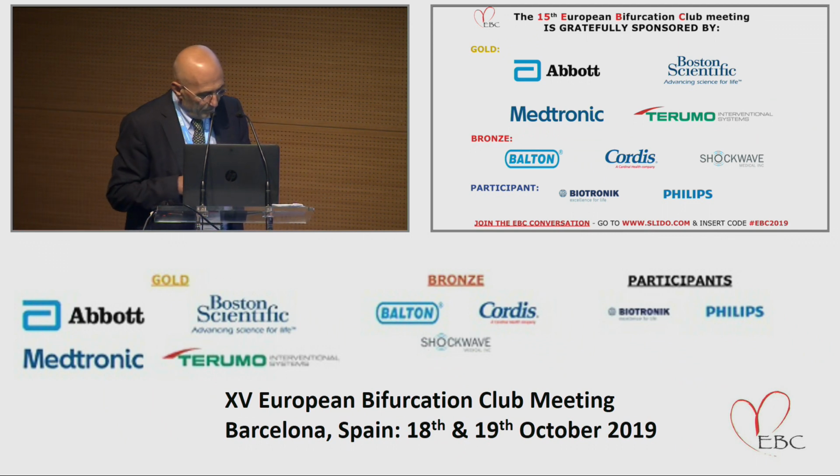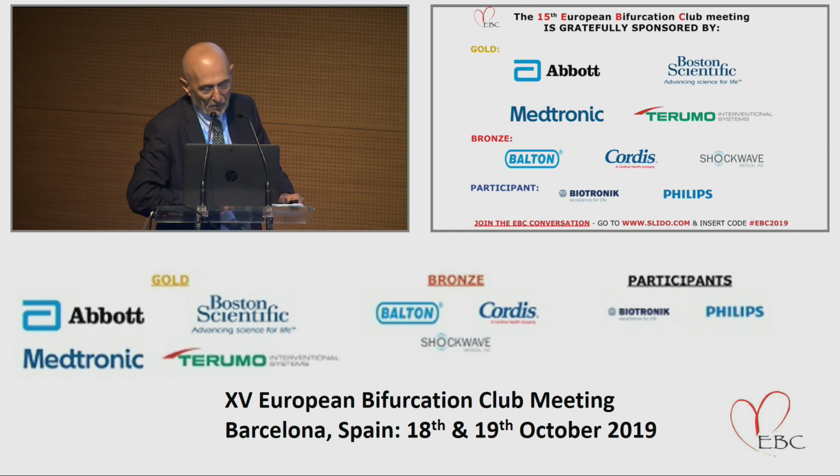So I'm trying to take the part of Chen in convincing you that when you are using the crush technique, to use DK crush. First of all, I think that we should recognize that this is not a conventional bifurcation. What we are speaking about is distal left main. It is a two main vessel bifurcation. So every time we should optimize what we are doing.